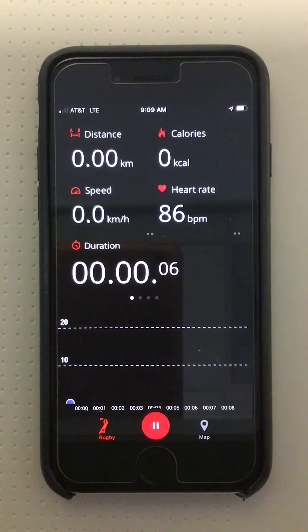PolarBeat automatically color codes the heart rate reading based on the percentage of heart rate max in 10% increments, according to the heart rate max that has been entered. If you do not enter a heart rate max, the app will automatically calculate a heart rate max based on the age of the user in the profile.